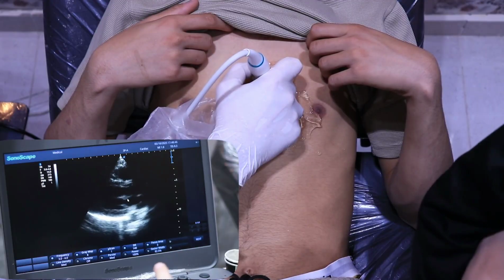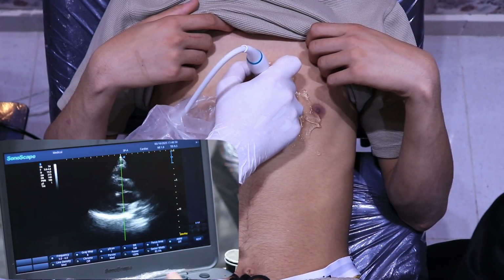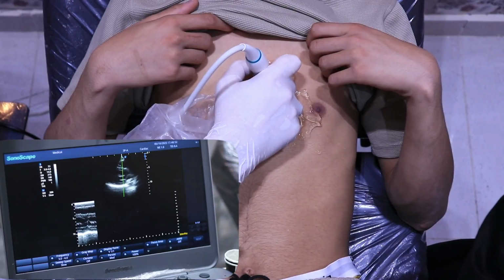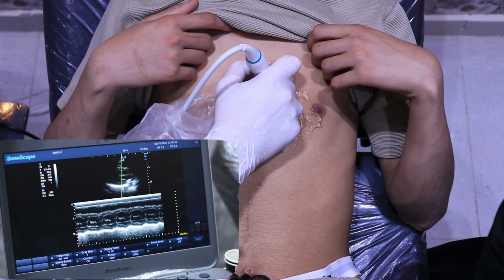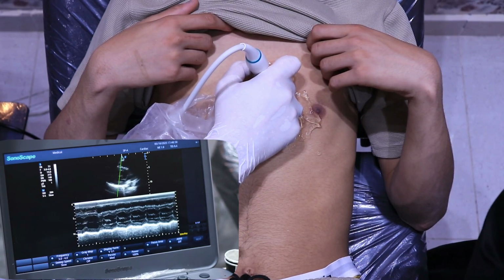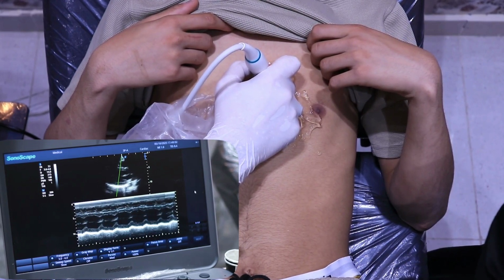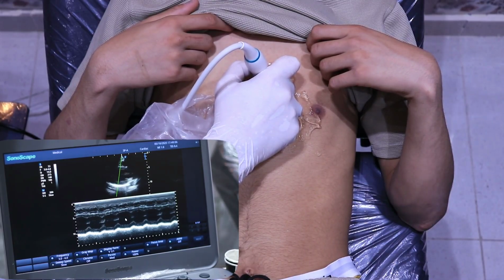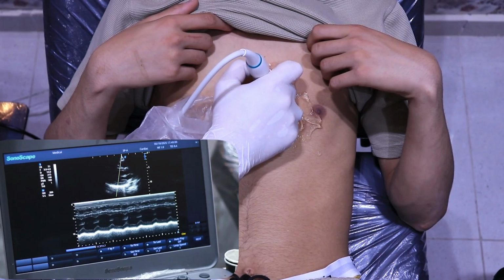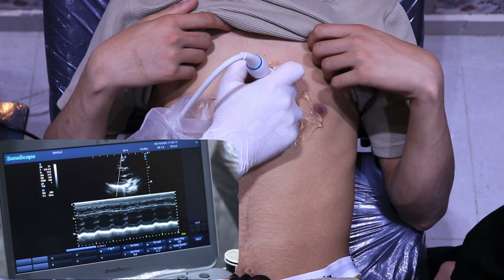And now we want to see the LV. We will update the M mode. You can see here at the level of the mitral, right? So we want to move away from the mitral. We go away from the mitral. Now the mitral disappeared. You can see here the mitral disappeared. There was a mitral here, it is gone, and now I have the LV. So this is the best view to measure the ejection fraction through the M mode.